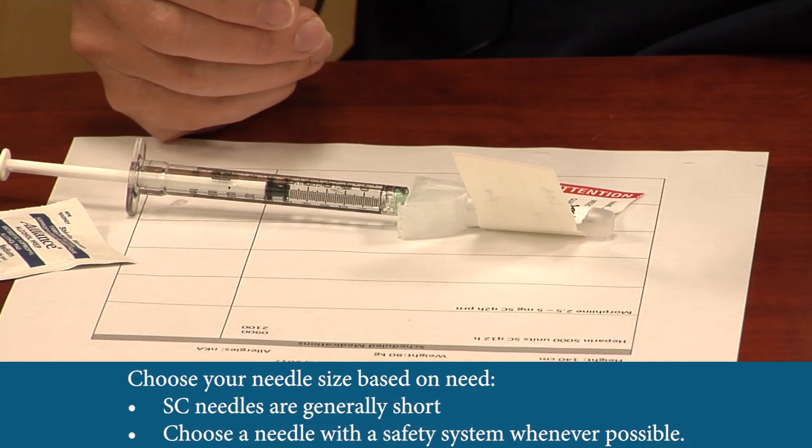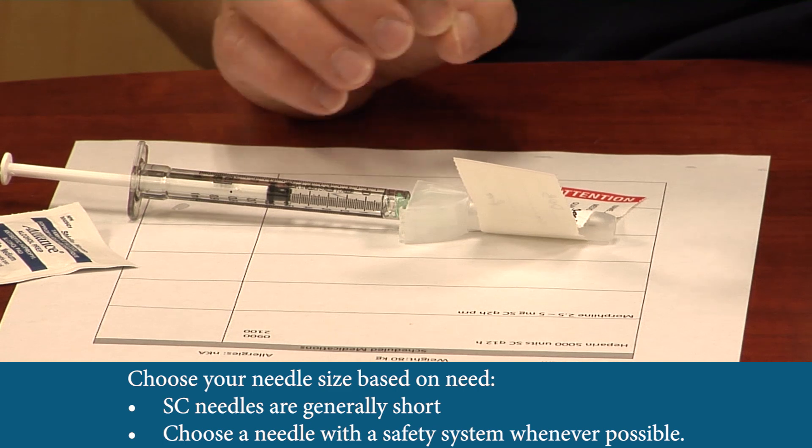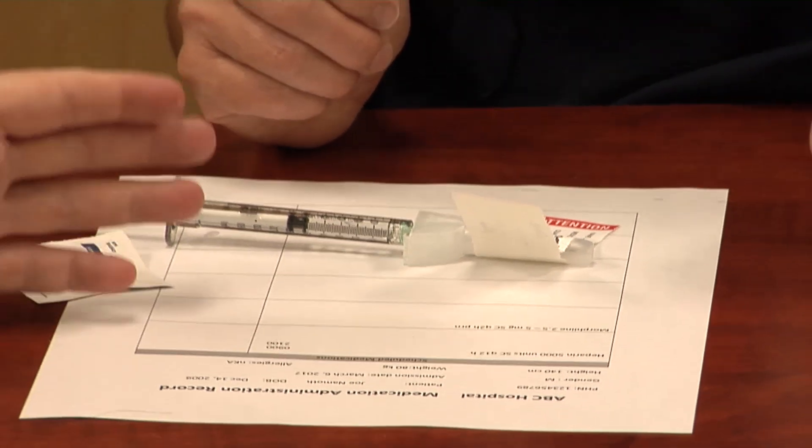I've changed over to my injection needle — this is a subcutaneous injection, and for a fairly healthy young adult, one inch is plenty. It's a safety needle, so whenever possible we should use safety needles to protect ourselves from needlestick injuries. For a bariatric patient, one inch is still sufficient for subcutaneous injection, but for an IM injection you would need a longer needle to ensure you reach that tissue.